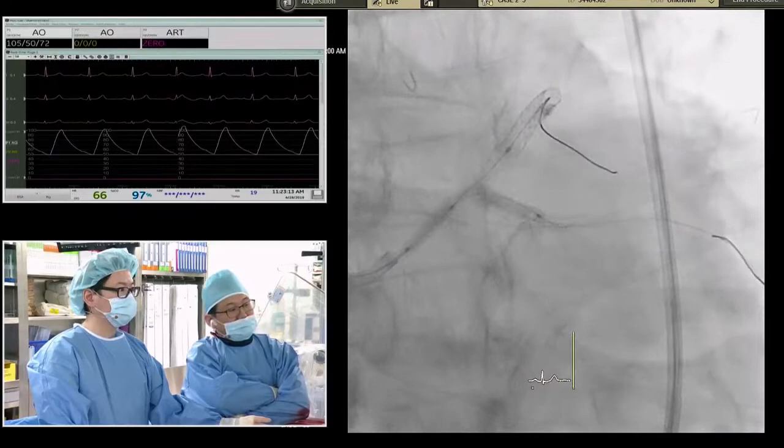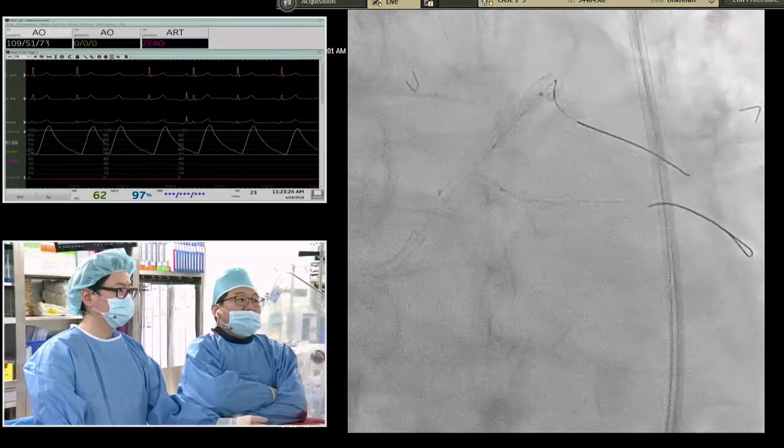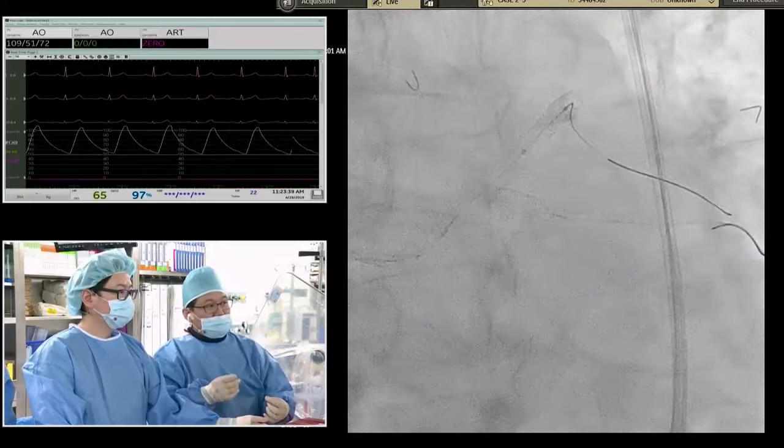This is a 2.75-28 stent. And then, why 2.75? I think the LAD is much larger than that. No, the circumflex 2.75. Yes. Thank you. Yeah, I insert the stent in the circumflex first. Yeah, 2.75, perfect, 2.75 first. Perfect. And then using the anchoring, I insert the balloon to the LAD stent. And then I insert a 2.75 high pressure balloon again, like this.